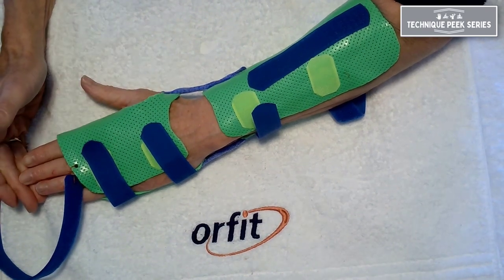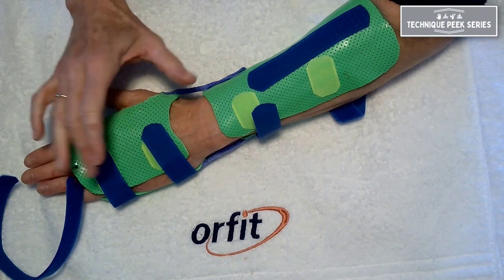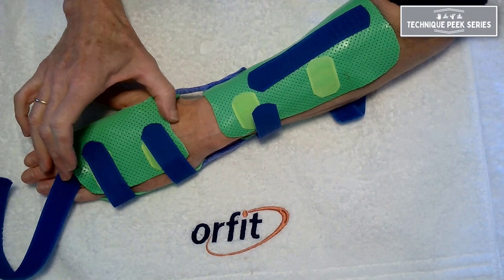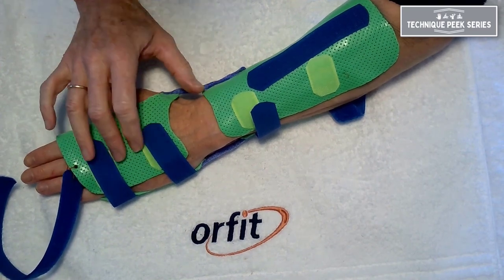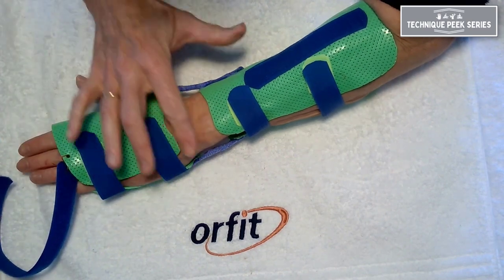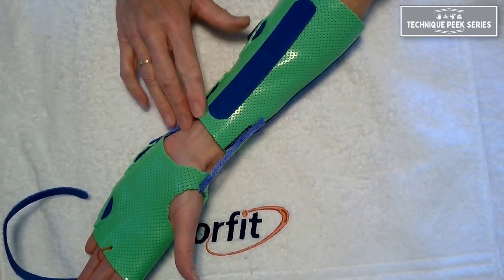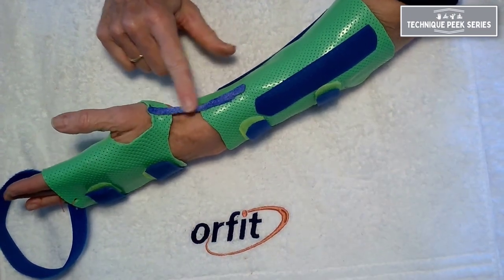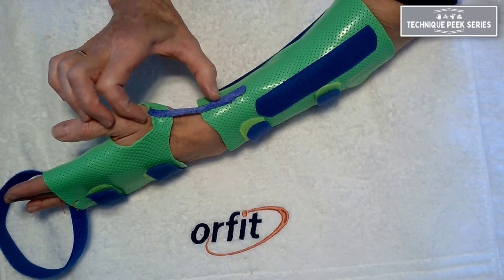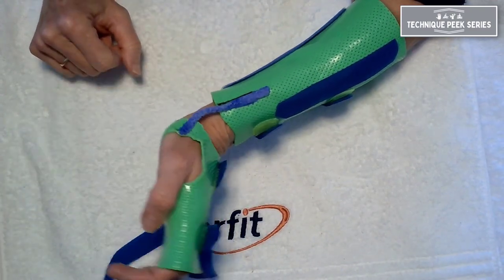You could go all the way to the fingertips, you could put the MCP joints in flexion, but we're getting more length than just going through the mid metacarpal — we're getting the extra length of the proximal phalanx. Once it's made in one piece we can cut it apart to free up the wrist on both sides, volar and dorsal, and put it back together with these hinges that maintain the same distance throughout the range of motion of flexion and extension.